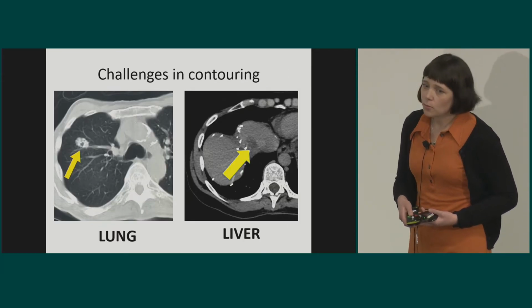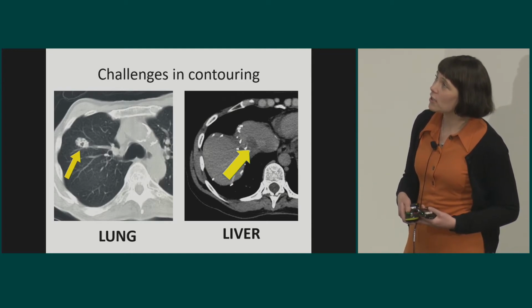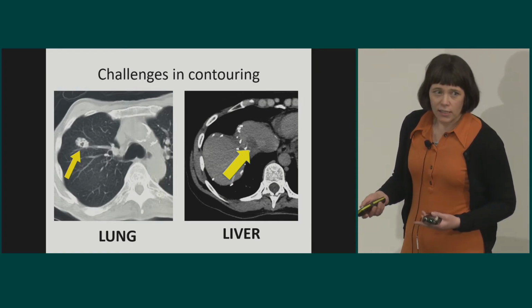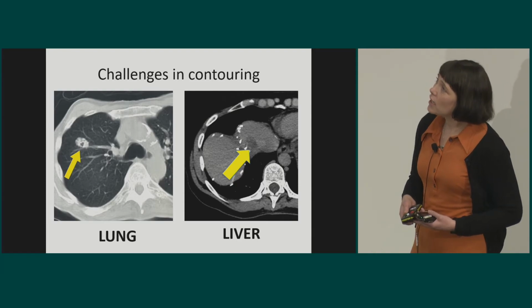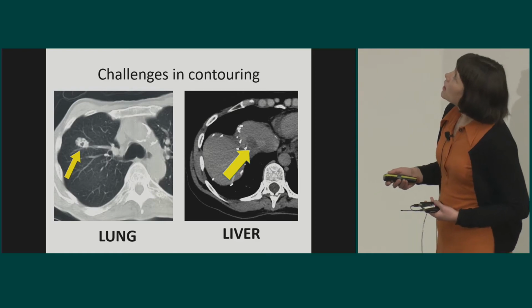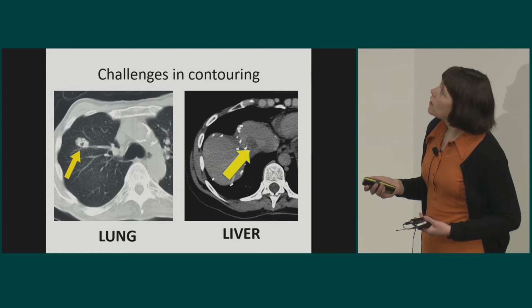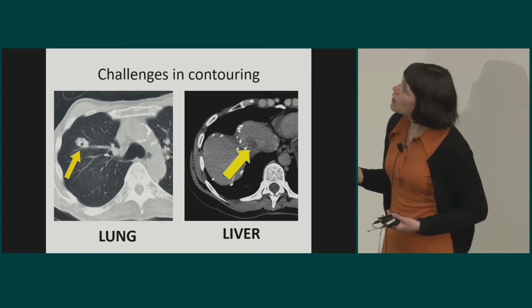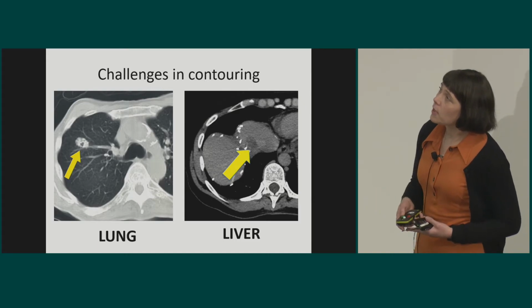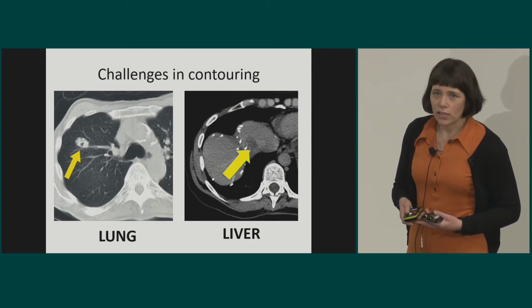So some of the traditional auto-segmentation techniques that are available are intensity-based or atlas-based. In the liver area, you can see here, there's not a great difference in the gradient between the surrounding tissue and the liver tumour itself. And then in the lung, you can see that some of these intensity-based or atlas-based methods would work very well. Also in the liver, you've got a lot of deformation.